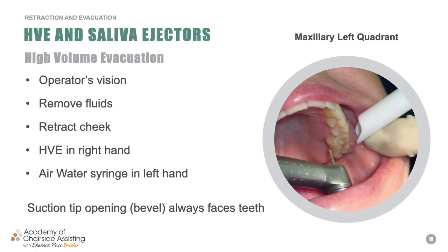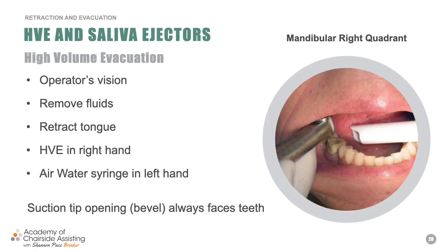Okay. So again, looking at the bevel, it always faces the teeth. You see where I am. If you keep that tip in that first molar area, you'll be golden. And then again, as you get more experience, it's going to come so easy. It's like riding a bike, I promise.